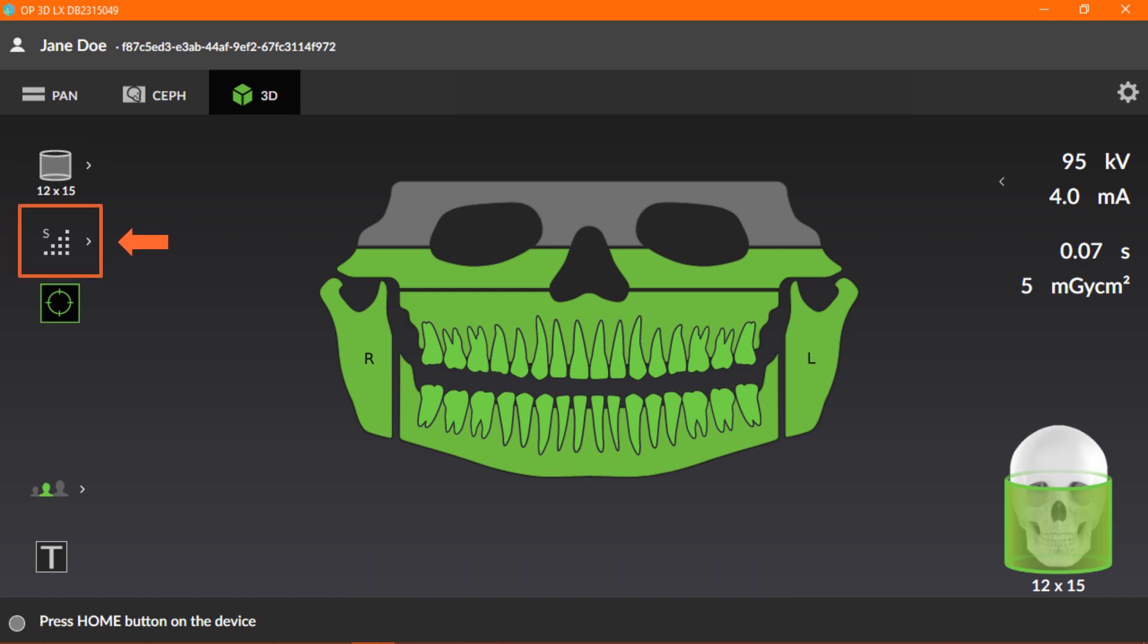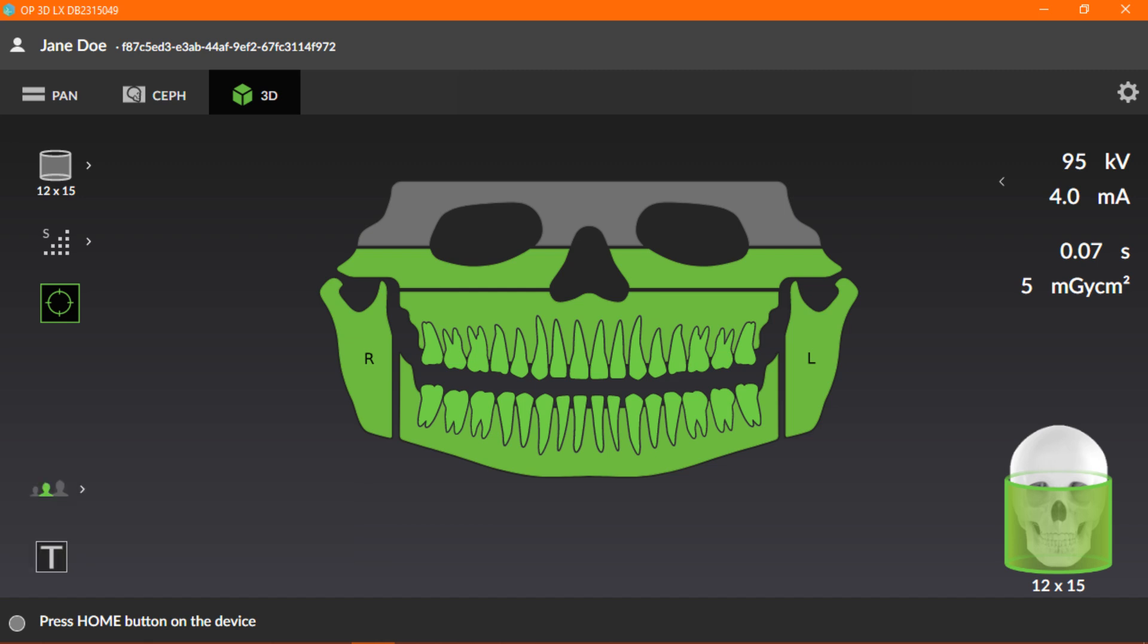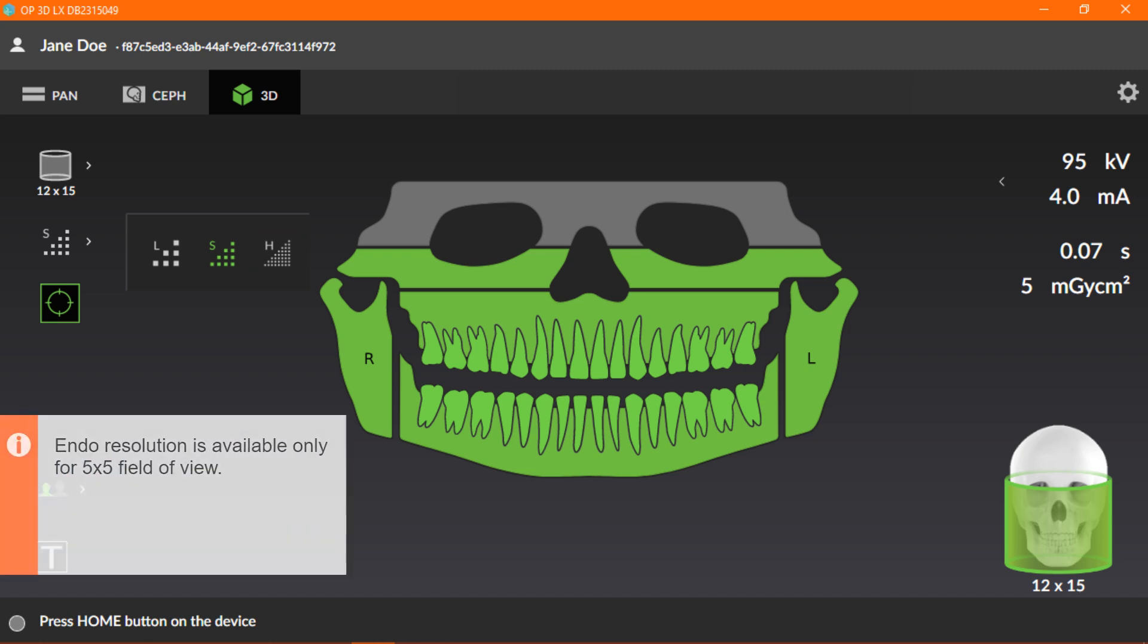Next is the image resolution selection. The resolution affects the image quality and radiation dose to the patient. Click the image resolution icon to display the list of available options. The available image resolutions are Low, Standard, High, and Endo. Please note that Endo resolution is available only when the 5x5 field of view is selected.